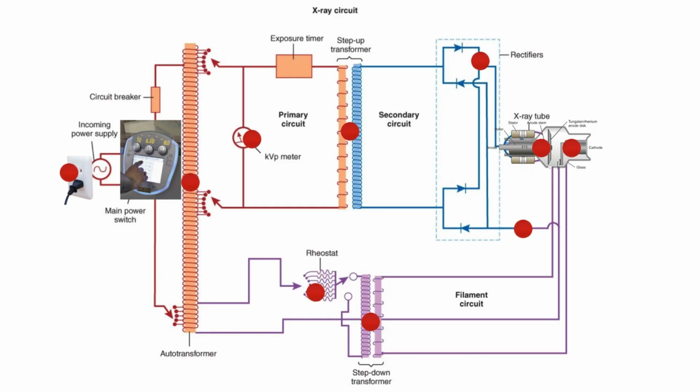And on that note, they're all happening when you prep the rotor. So when you get that exposure button, you press it halfway down. What you're doing is you're running electricity through all these different components and setting up your potential here in the X-ray tube.